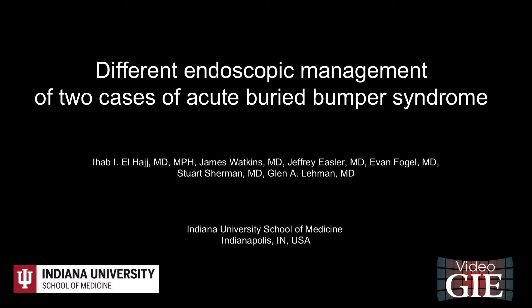This video demonstrates two different endoscopic techniques for the management of two cases of Acute Buried Bumper Syndrome.